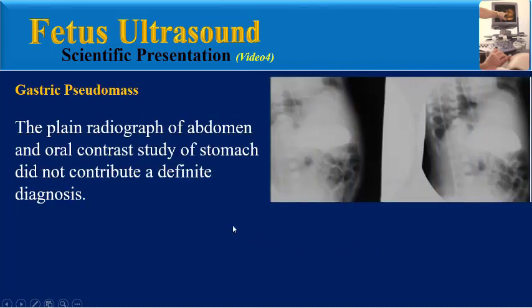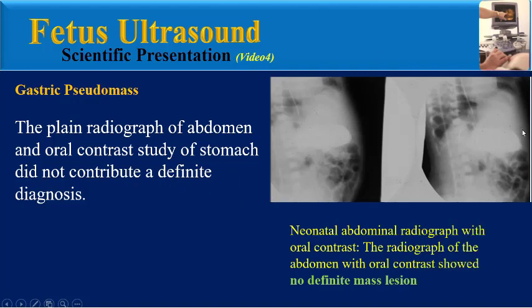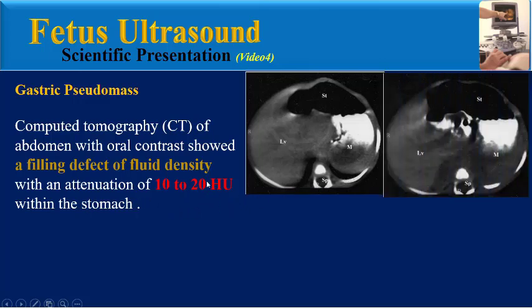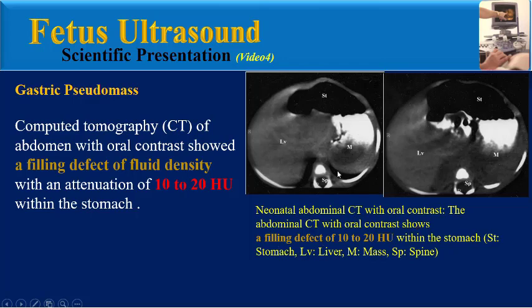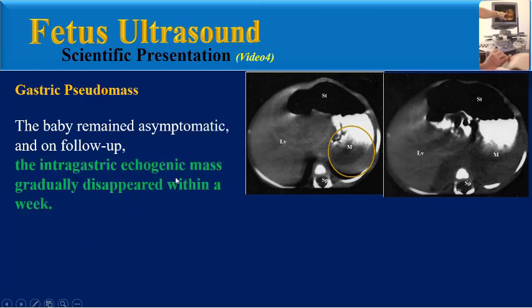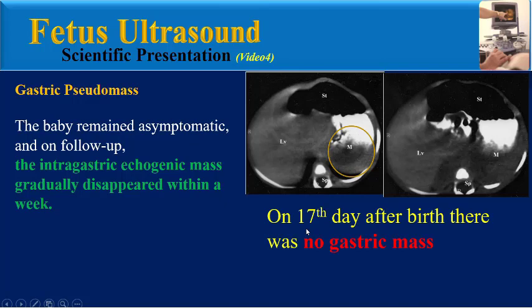A thin spike of very low velocity color flow was demonstrable at the periphery. The plain radiograph of abdomen and oral contrast study of the stomach did not contribute a definite diagnosis. As we can see in this abdominal radiograph with oral contrast, there is no definite mass lesion. CT of abdomen with oral contrast showed a filling defect of fluid density with an attenuation of 10 to 20 HU in the stomach. As we can see in this abdominal CT, a filling defect of 10 to 20 HU in the stomach. The baby remained asymptomatic and on follow-up, the intragastric echogenic mass gradually disappeared within a week.